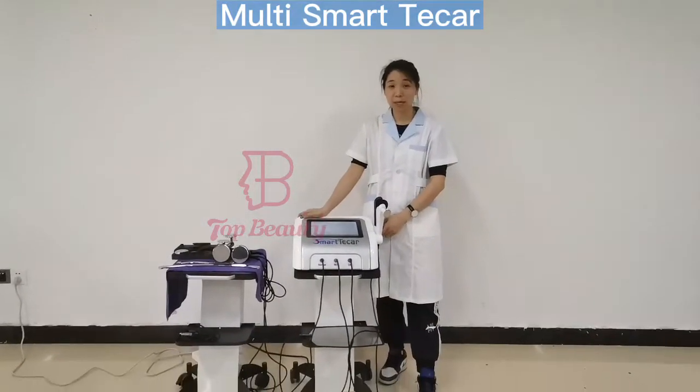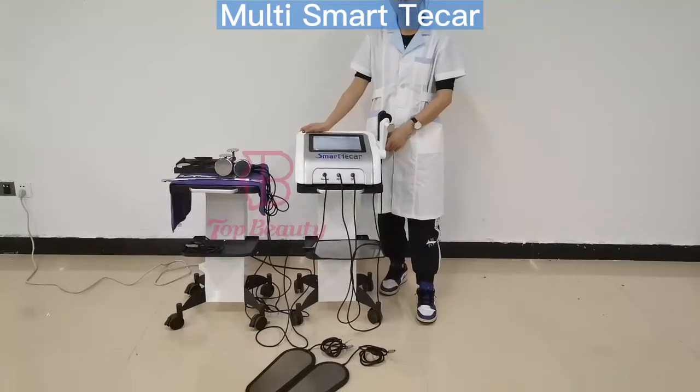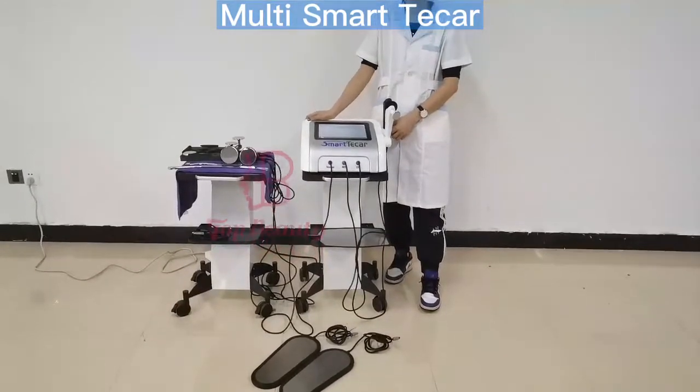Hello, this is Tobi. Today I would like to introduce you guys to the Optus Multifunction RF device.